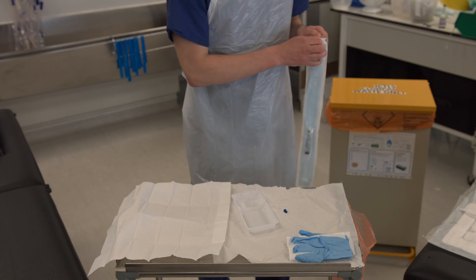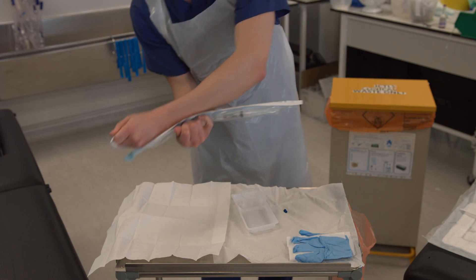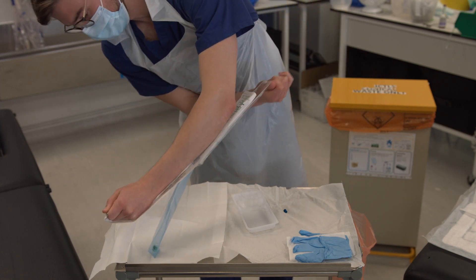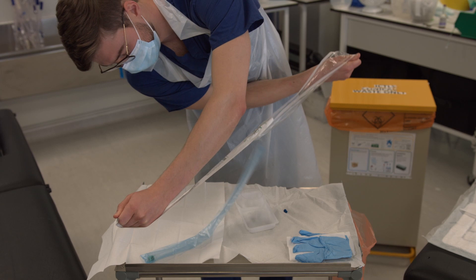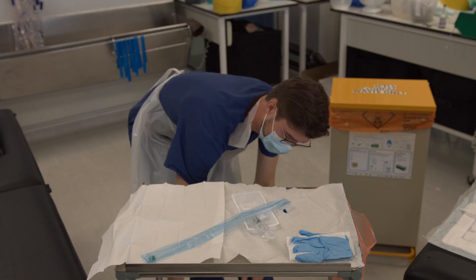Open the package and allow the catheter to fall onto your sterile field. This is easiest to do if you hold the package plastic side down as shown. Place the packet on the bottom of your trolley to retain the labels.